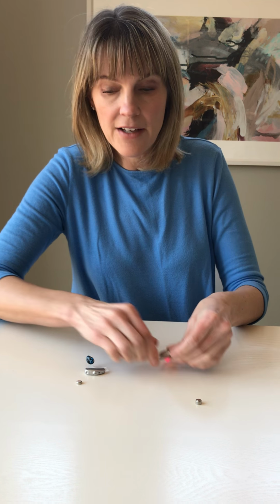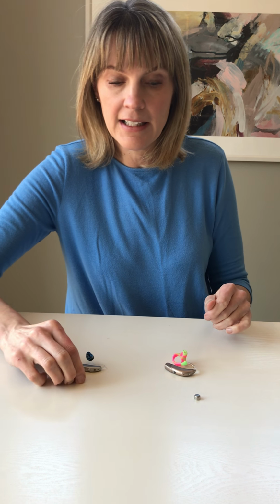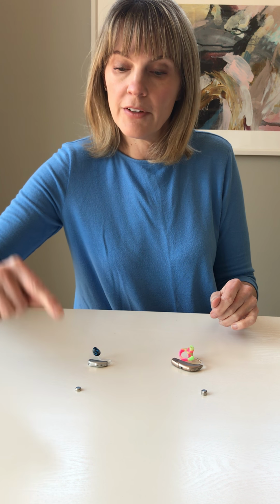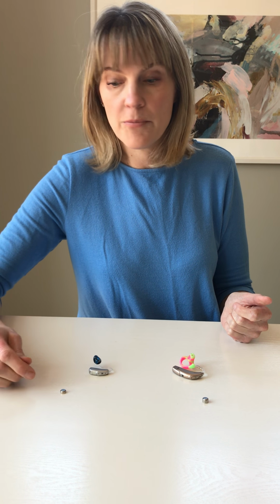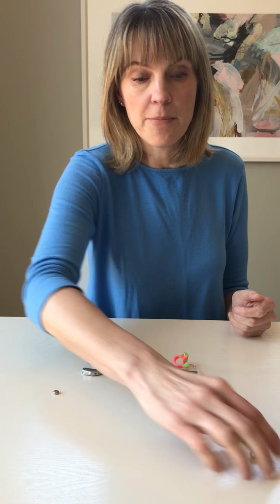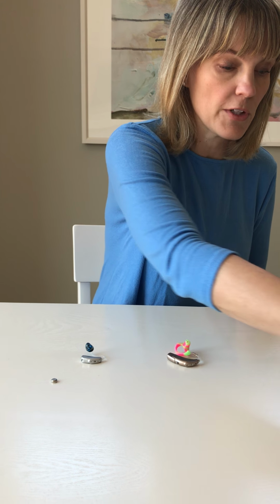So if I have a hearing aid that's not working, I'm going to take the battery out of the hearing aid and then I'm going to give it a drop from a couple inches above. If I drop my battery and my battery just sits there, I have a good battery. So the problem is not my battery. If I drop my battery and the battery bounces like that, I have a bad battery. Bad batteries bounce. So at this point, I would know this is a bad battery. I'm going to dispose of it.